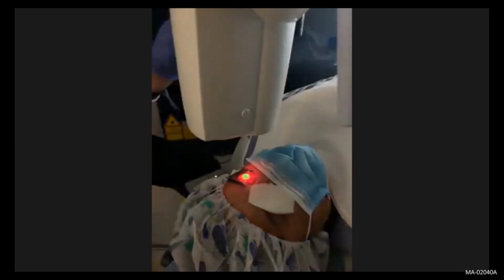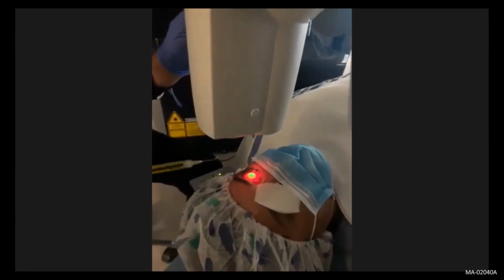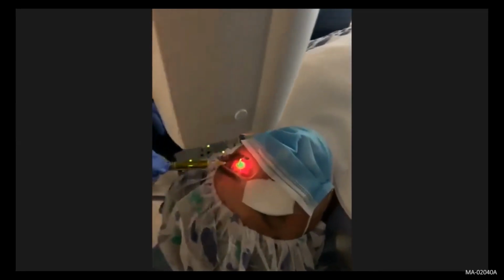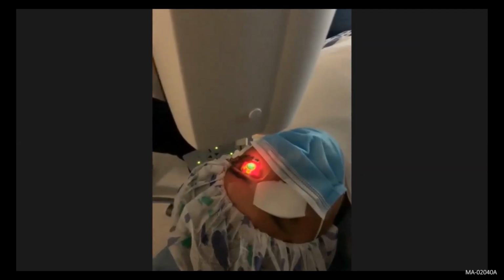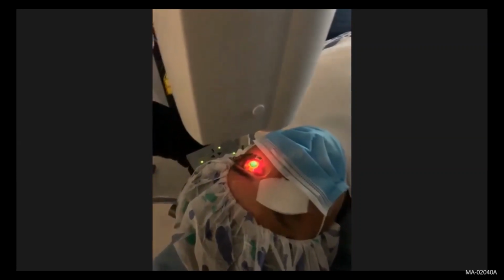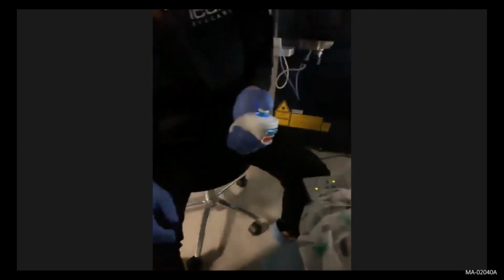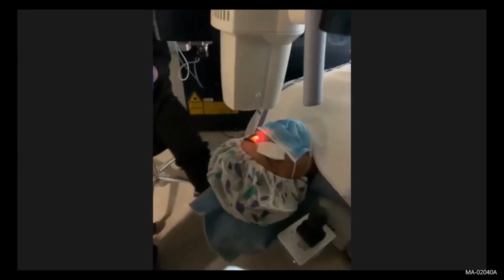And we're starting the treatment now. Just want to get the crosshair fully lined up, and again we'll continue with a drop every 2 minutes for half an hour. It has a nice little remote control so you can keep your patient completely centered and focused on the light.